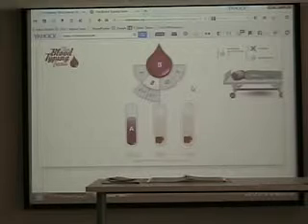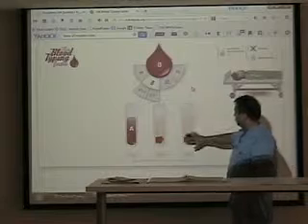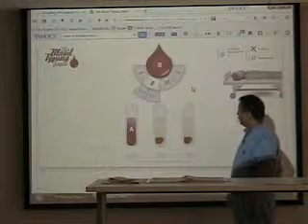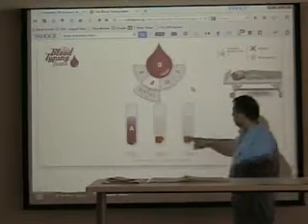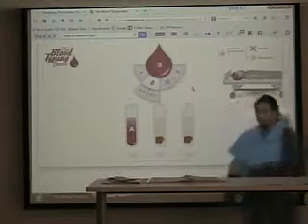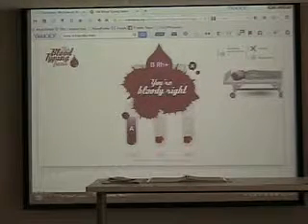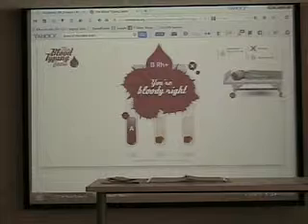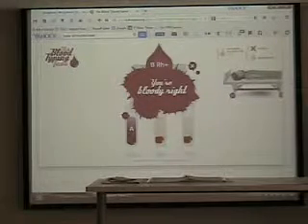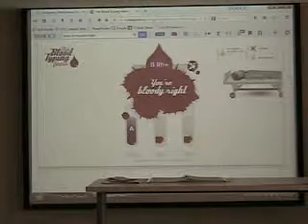All right, wonderful. We're right so far. Now, RH. Is there a reaction? Yes. There's clumping, there's agglutination. So if there's a reaction, that means there's what? There are RH antigens present. If there's RH antigens present, then that has to be RH positive. So my patient's blood type is B positive. And I am bloody right. Okay? Go through this game several times. Go through several patients several times. Let's try another one.